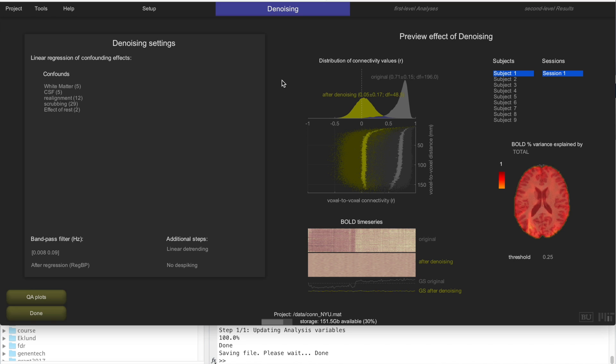Here we are at denoising. Denoising is where we clean up the data to get it ready for functional connectivity analysis. Unlike preprocessing steps that are applied to all fMRI data — whether for functional connectivity or activation analysis — denoising is very specific to functional connectivity analysis. It's a set of techniques developed over the last few years proven to improve the quality and replicability of functional connectivity measures.